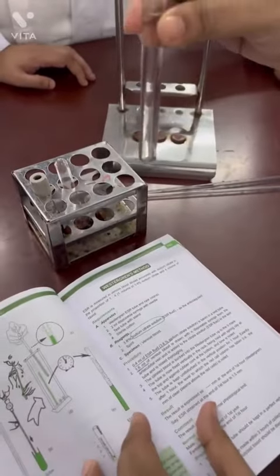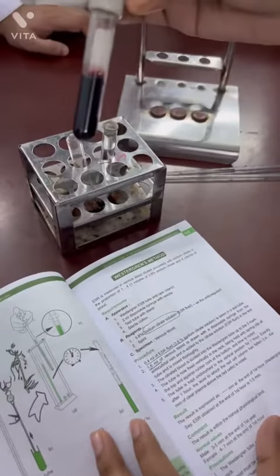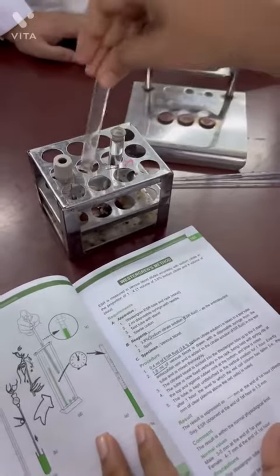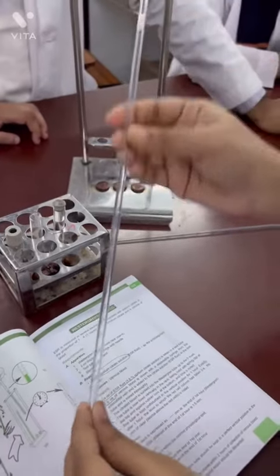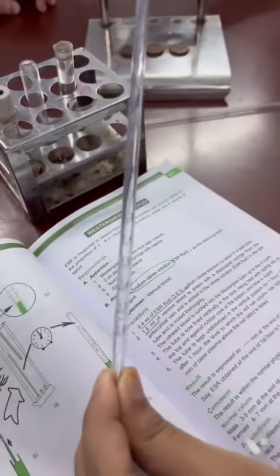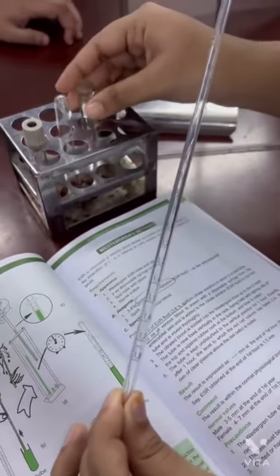This is the 3.8% sodium citrate solution. This is the blood sample. The sodium citrate solution is used as the anticoagulant for the ESR test.